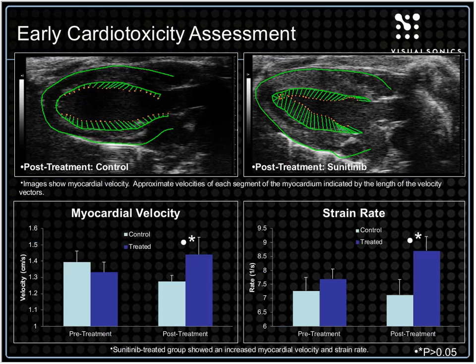Also important to note that while there are major cardiotoxicity parameters, you can also use certain software packages like VEVO Strain that assess, as shown in this image, early changes in the wall of the heart, the way it moves, before and after treatment, and use that to assess if there are potential cardiotoxicities. You don't have to wait till there is a huge collapse in the heart's function. We will discuss more about how to assess cardiac function and early markers of cardiac function in our webinars on cardiac health or heart health.